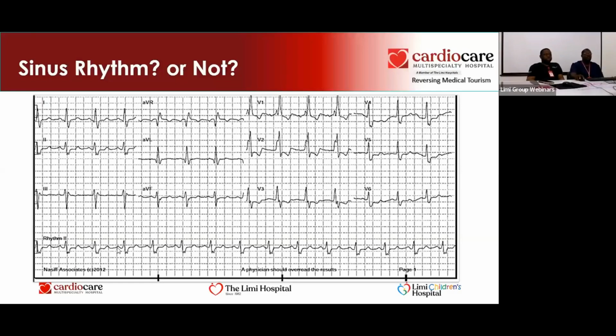And the last one, the P waves, are they looking alike? So irrespective of how the QRS is looking, this is a sinus reading, which you have answered. Leave the QRS, we'll get there on another good day.